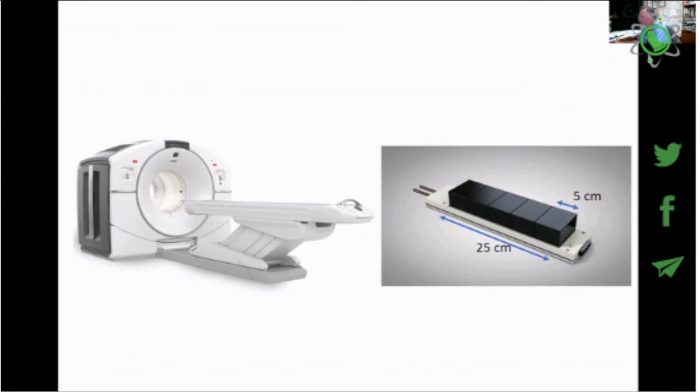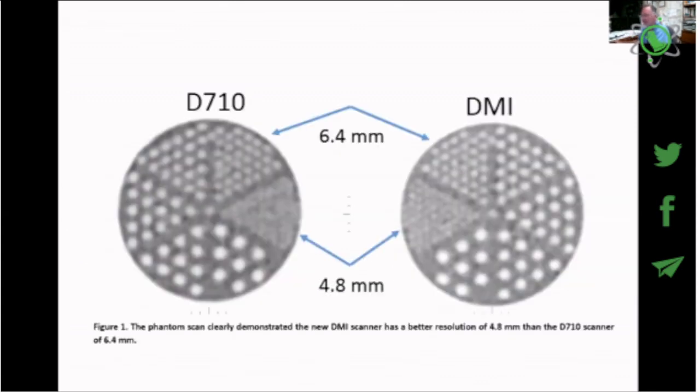Like I said, the different manufacturers now provide digital type detectors. These were originally developed for PET-MR machines rather than PET-CT scanners. And from General Electric, like I said, they come in either 15 centimeter, 20 or 25, or even now 30 centimeter. Siemens also has digital type detectors.